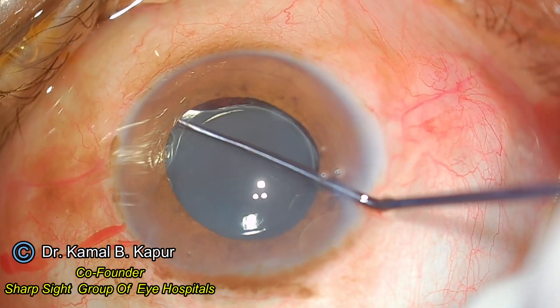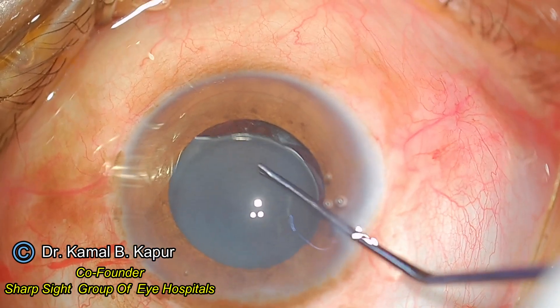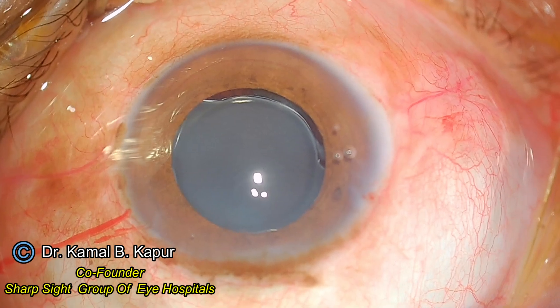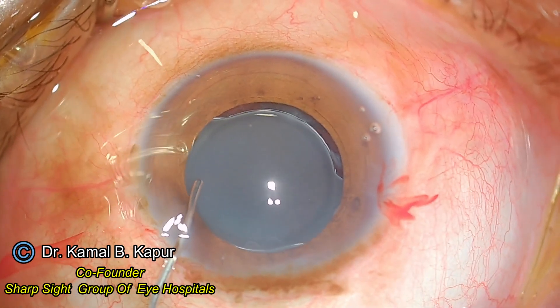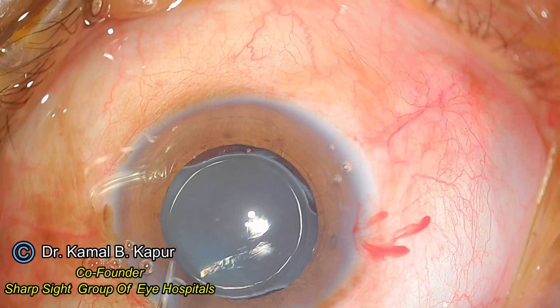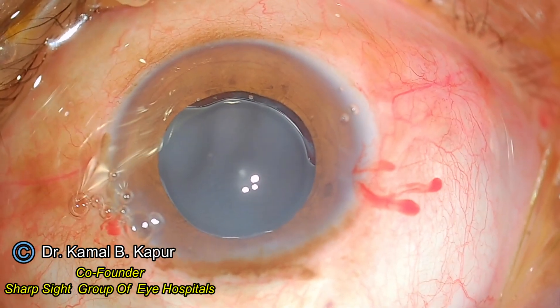I push back using a blunt instrument first of all to identify the leading haptic — does it have any adhesions, is it caught behind the capsule or is it free? To my relief, I find this particular haptic to be free. So I use more viscoelastic, pushing the eye well slightly backwards.